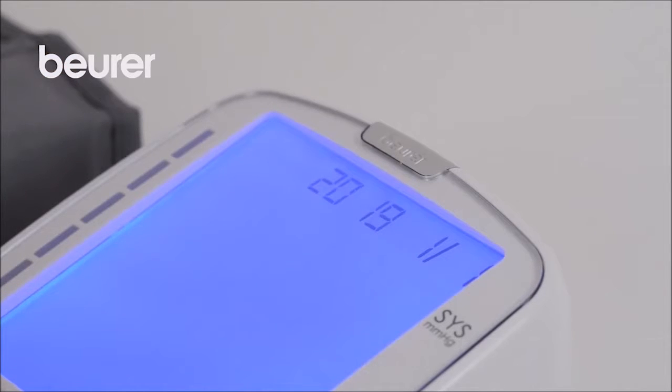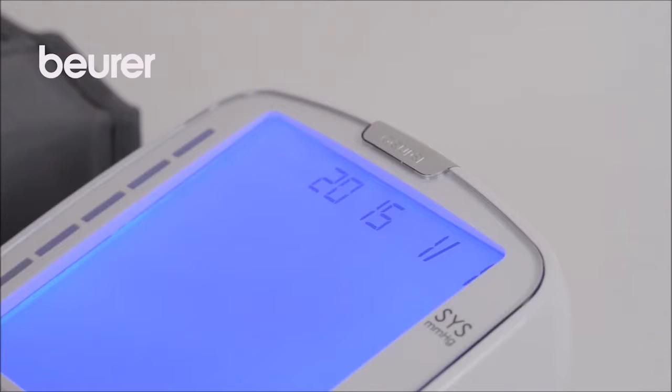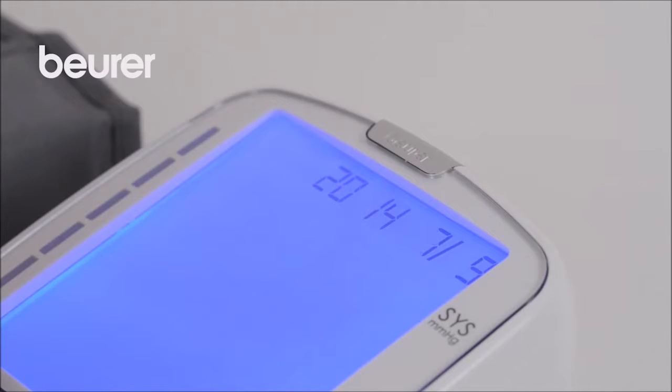The year display will start to flash. Press the function buttons plus or minus to set the year. Press M to confirm. Set the month, day, hour and minute in the same way. Confirm each using the memory button M.